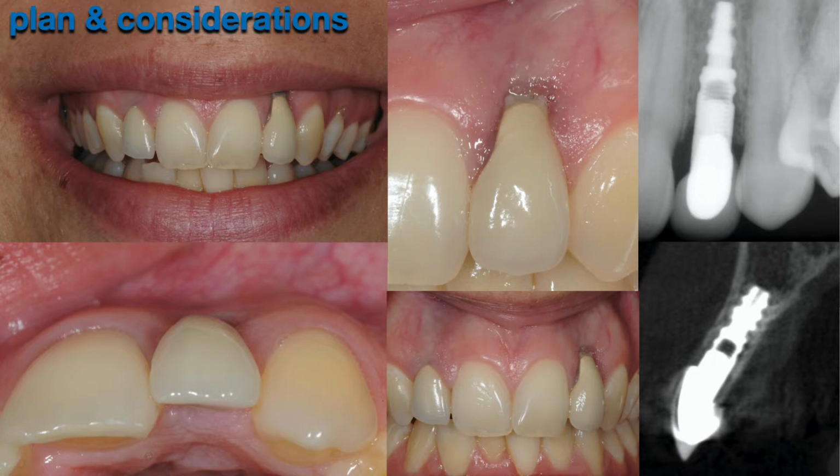So what are we thinking about here? This patient came to me. I told her, look, the first thing we need to do is get a restorative plan. We knew that certainly there are some challenges in terms of soft tissue, bone, and position of the implant. But really, it all starts with a restorative plan. So what was the conversation that you had?